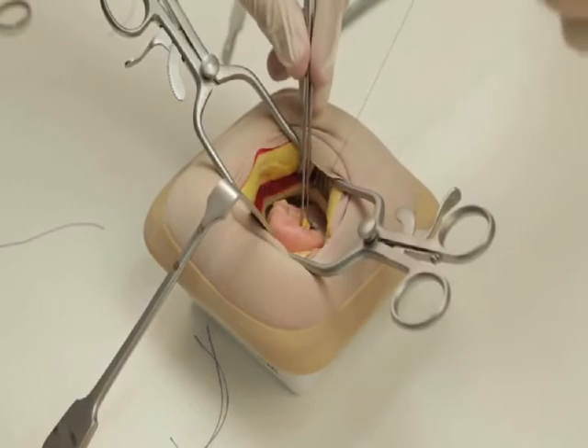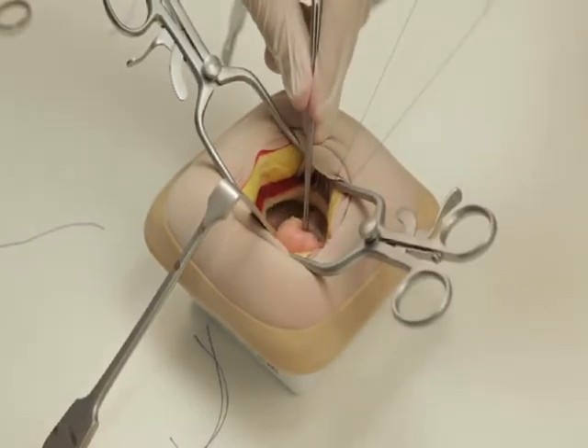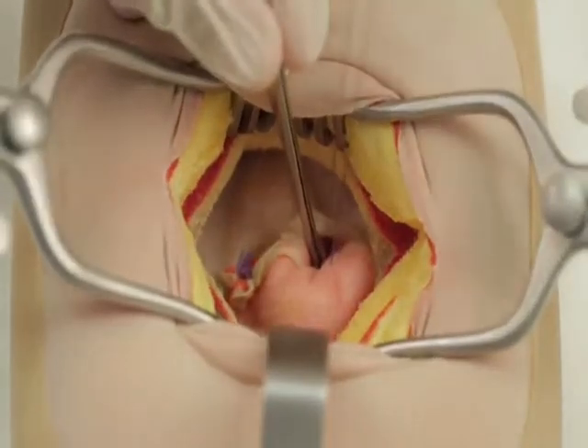Ask your assistant to push the appendix base using non-toothed forceps whilst you tighten the purse string to bury the stump.